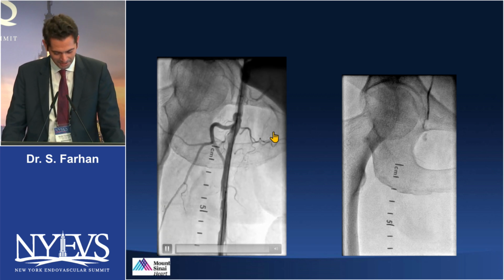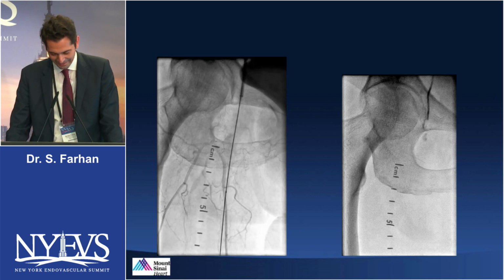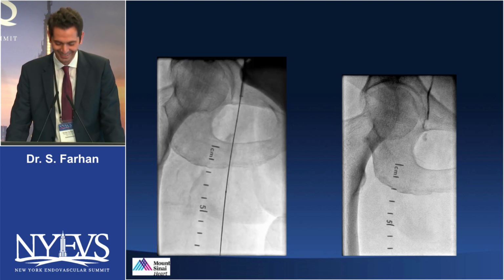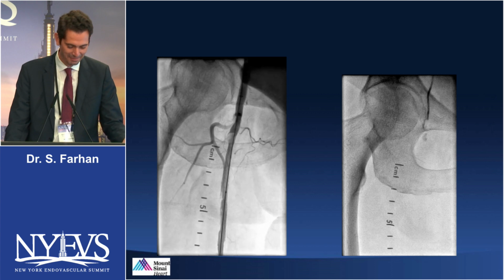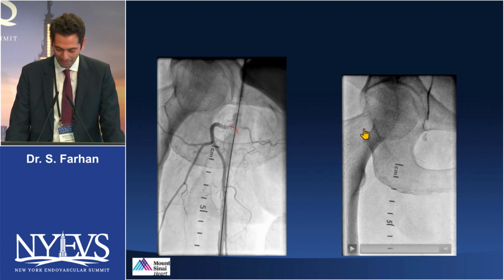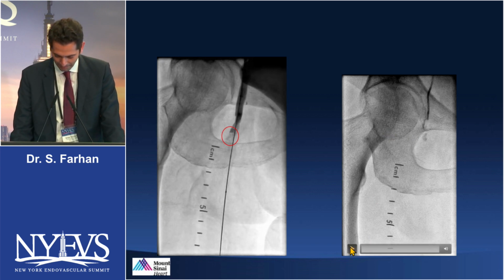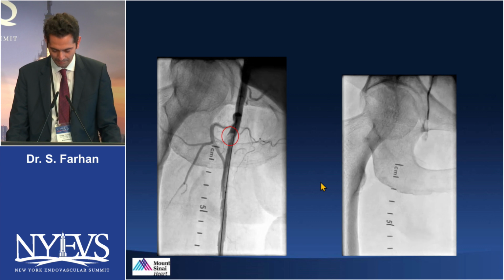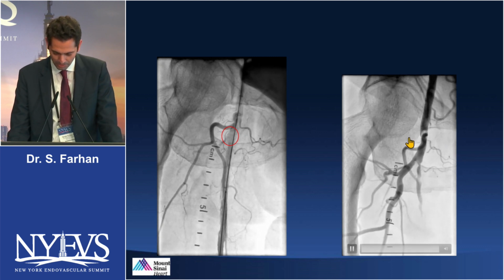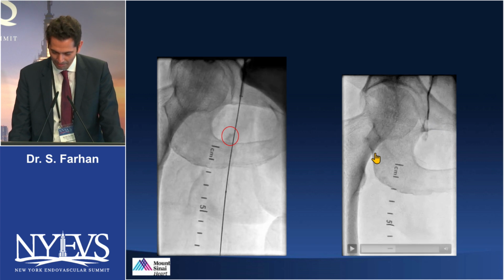And one of the colleagues in the cath lab said, why don't you call Serdar, he just started. So I came to the room, and, as mentioned, it was a straightforward case. So for recollection, this was the initial angiogram. And as you can see here, this dislodged thrombus or material was likely in the common femoral artery.